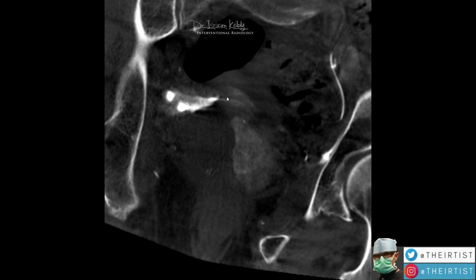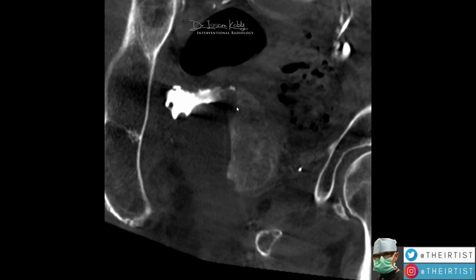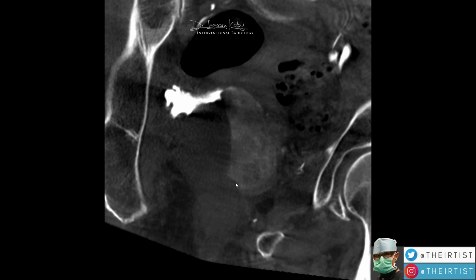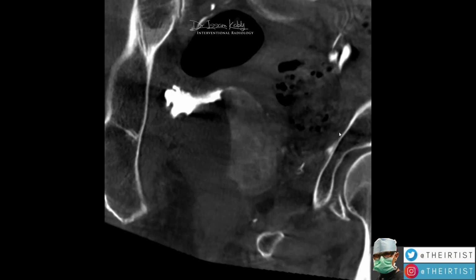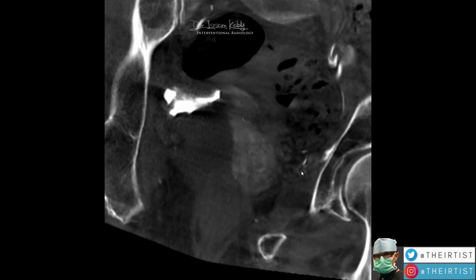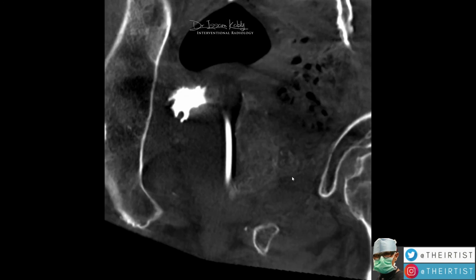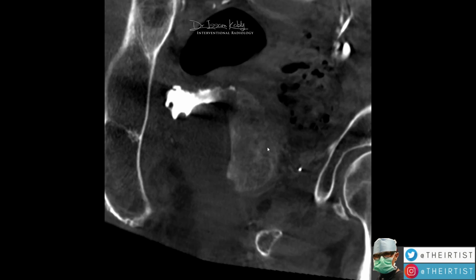Here we're looking at it from the front, exactly as we were looking at the angiography, and you can see the enhancement of only one half. It's perfect delineation. Every artery goes to one lobe of the prostate. We are coming from here. This is our microcatheter. If you can follow it on the 3D, I'm going to try to follow it to show you where it goes and where it's going to end up. So we are super selective, super close to the prostate gland.